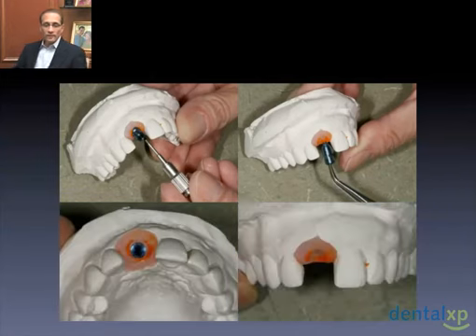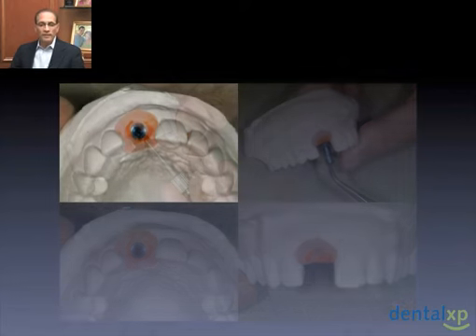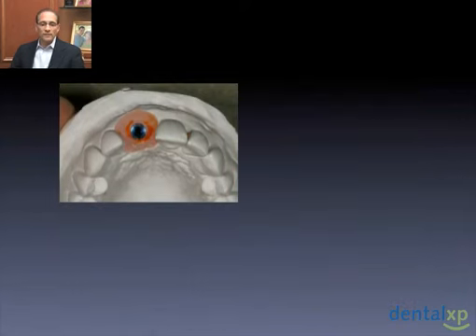Now, I have exactly what I left off with in the soft tissue chairside. I can go ahead and from there evaluate my situation, try to get a better handle on how much more tissue contouring I may need in order to support the papilla and create the soft tissue scallop on the facial where I'd like it to be.